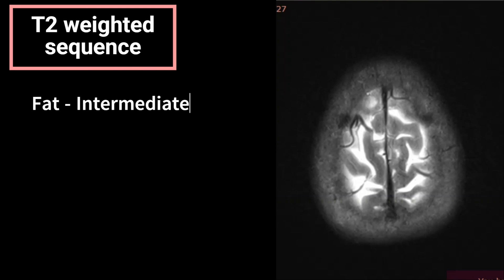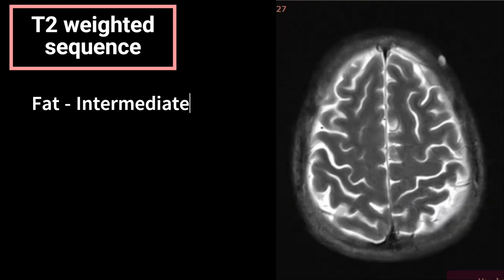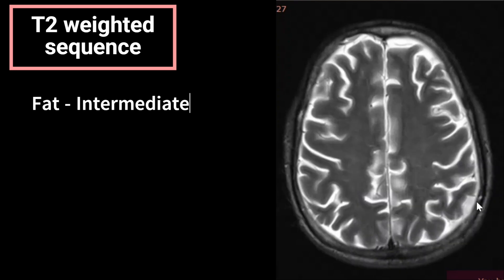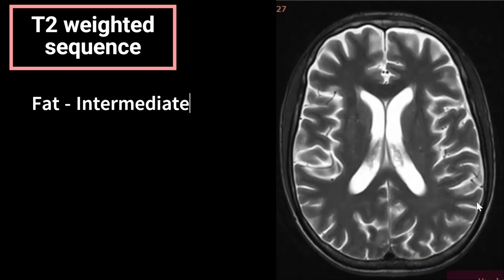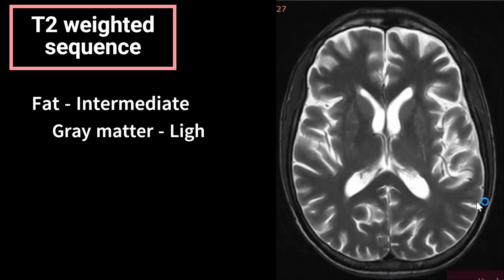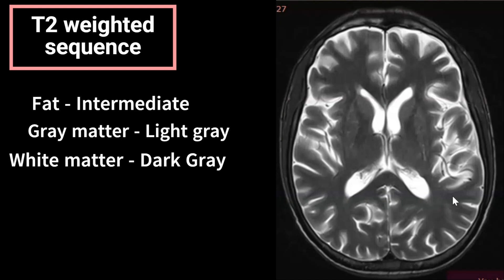Coming to the T2 weighted sequence: fat appears intermediate to bright, so the subcutaneous fat appears intermediate to bright here. Going to lower sections where we can see gray matter and white matter clearly — gray matter appears light gray on T2. We trace the outer cortex appearing light gray, which is opposite to what we saw on the T1 weighted sequence.